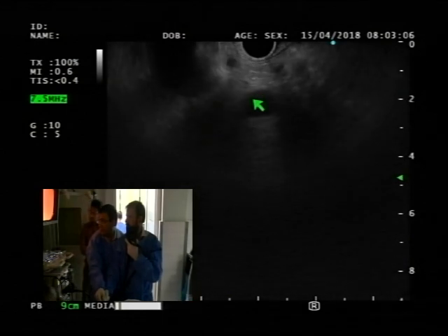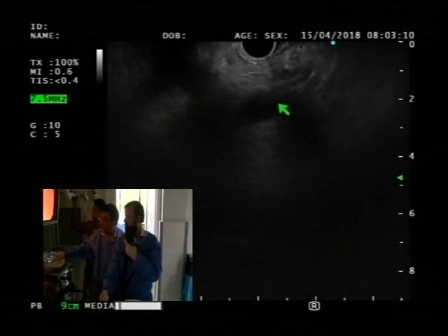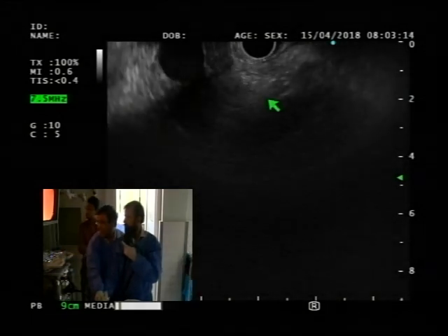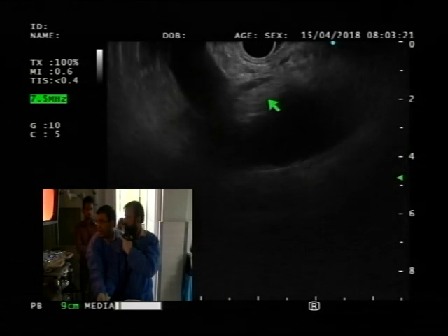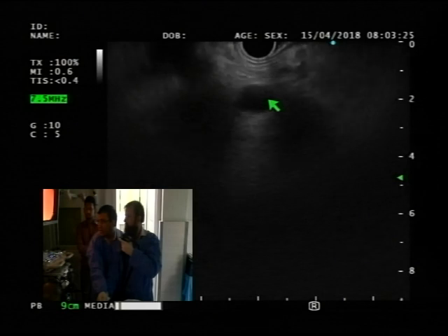Now slowly advance, slowly advance. The left gastric is big wheel towards you a little bit. Left gastric is coming right here. Okay. And now advance with the big wheel towards you, please. Big wheel towards you. Okay. So right here, you see that, right there. Just slowly advance.